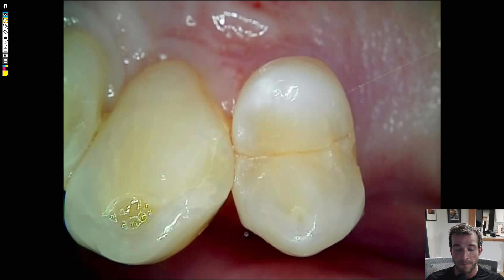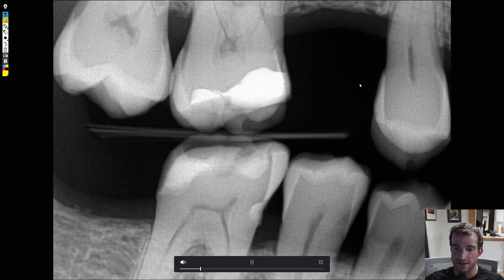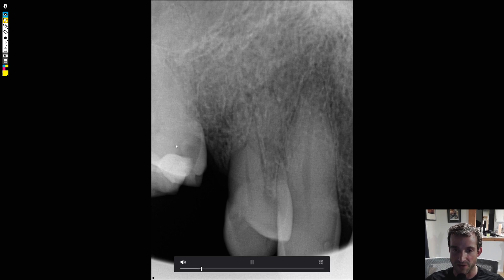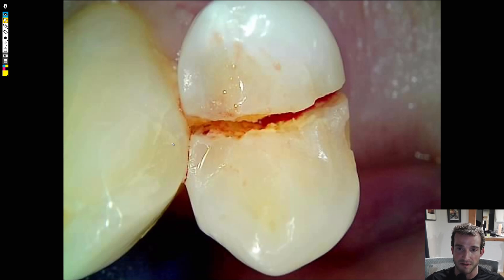So we got him in, took an x-ray — the bite wing doesn't show anything remarkable. We took a PA and similarly the PA doesn't really show anything remarkable that would explain the symptoms. There's no lesion at the end of the roots, a little bit of periodontal bone loss, but that wouldn't really account for why it hurt so much to bite on. On the clinical exam, we took an explorer and poked the tooth and he yelled 'ouch' because the tooth is split right down the middle.